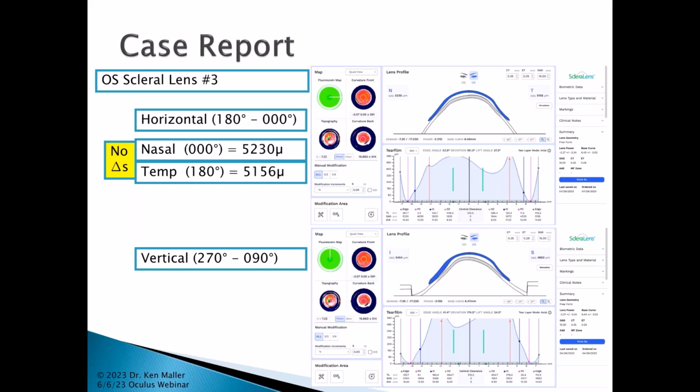Perfect. I think that's a great explanation for what that question was trying to ask and my interpretation of it. I have a few more questions for you. Go ahead. You talked about CSP measuring out to 18 pretty consistently. If you are fitting a 15 millimeter lens, do you need the data out to 18 millimeters?